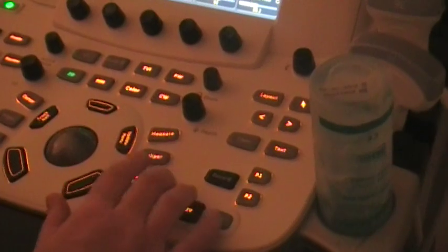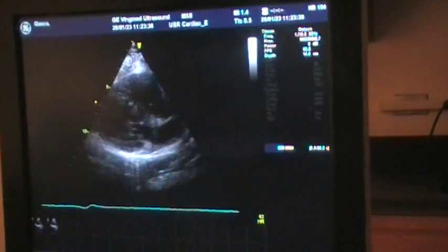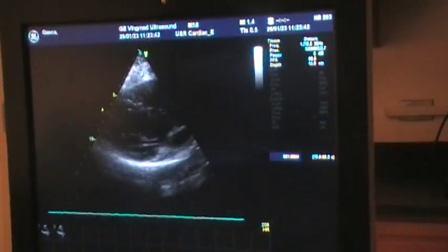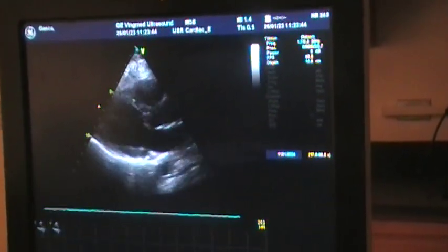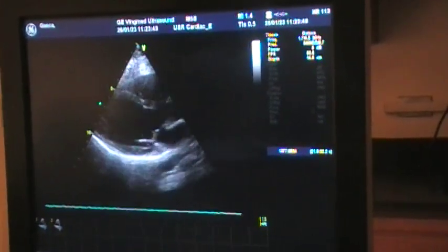So depth out, image store, we'll do your clip. So each time you're clicking that, that's to start the clip and then to end the clip. Now if it's recording before what you just did, you just hit image store and it'll do like the last 3 beats. So if it's doing after, then you would clip it. Yeah, so it just depends on how they've got it set up at your place.